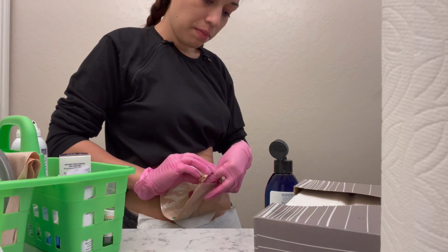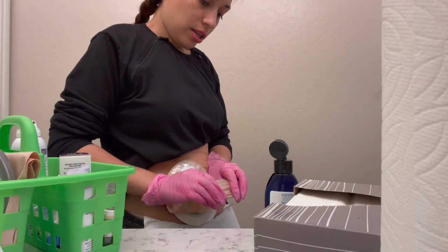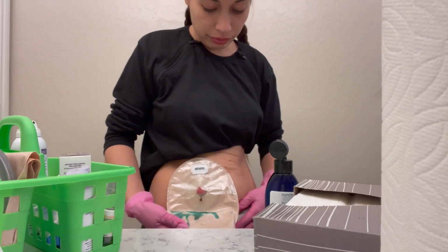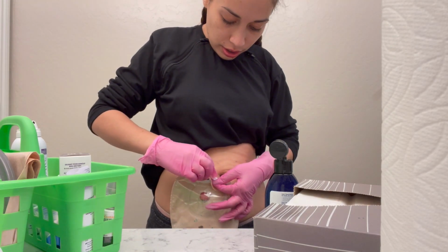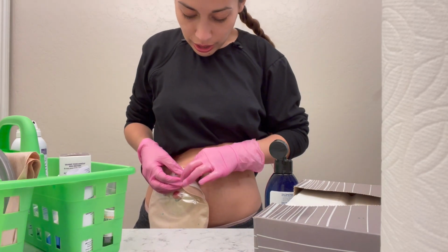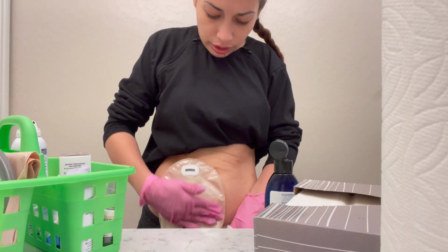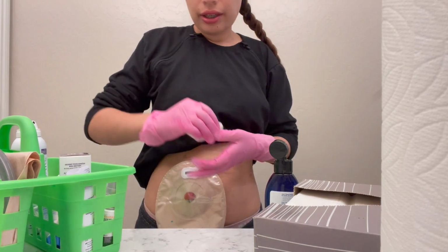So what I do is I tuck it back first in here. I tuck it in the back. And then this little lip, I tuck it this way. That way it doesn't open. And if it does leak, this will catch it. And then I just take this off, throw it in there, and then take off these. On the side, make sure those are on there. This one, I like to tuck into my belly button. And then I take that off. Make sure that it's nice and on there. And there you go. That's how I change my bag.